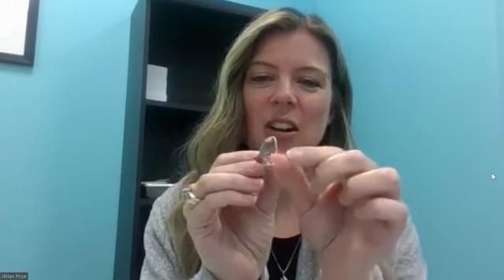So if I'm holding this hearing aid, if you remember from before, the only reason that the end piece is red is because in all things hearing aids, the right is always color-coded red and the left is always color-coded blue. So if it's supposed to be on your right side, it's going to be red. If it's supposed to be on your left side, it'll be blue. So they've colored the end red to tell me, hey, this goes on a right hearing aid, nothing else. I can't put a left on there, it won't work.